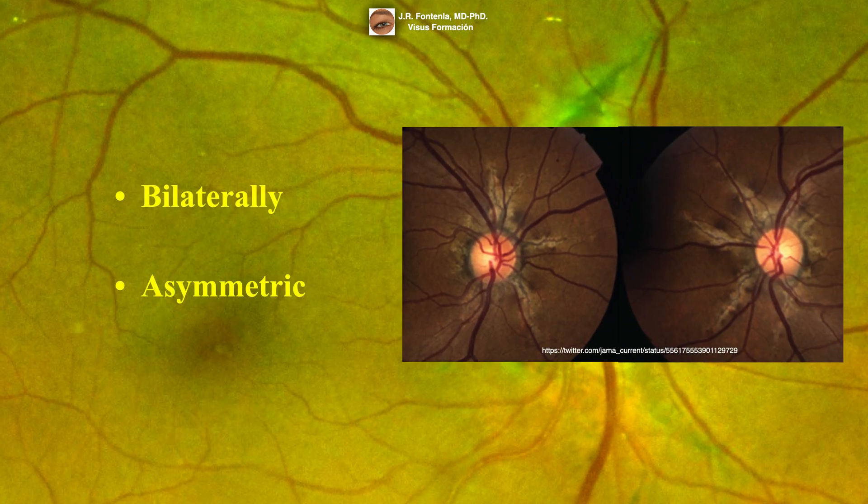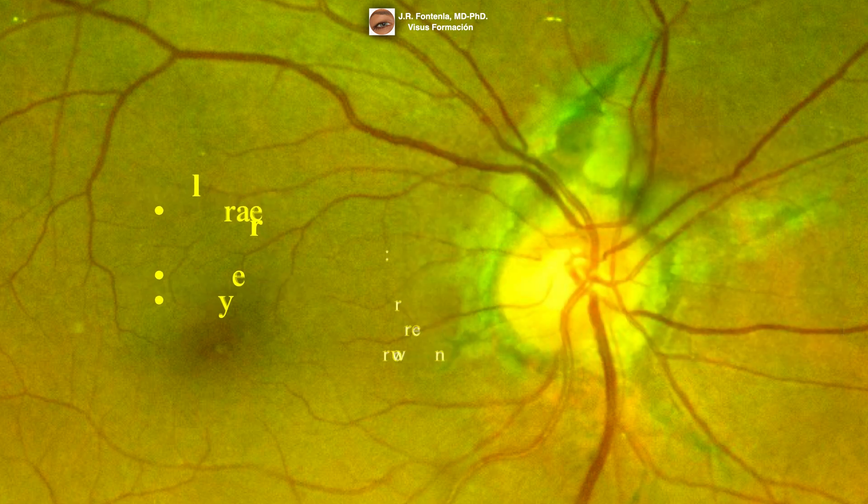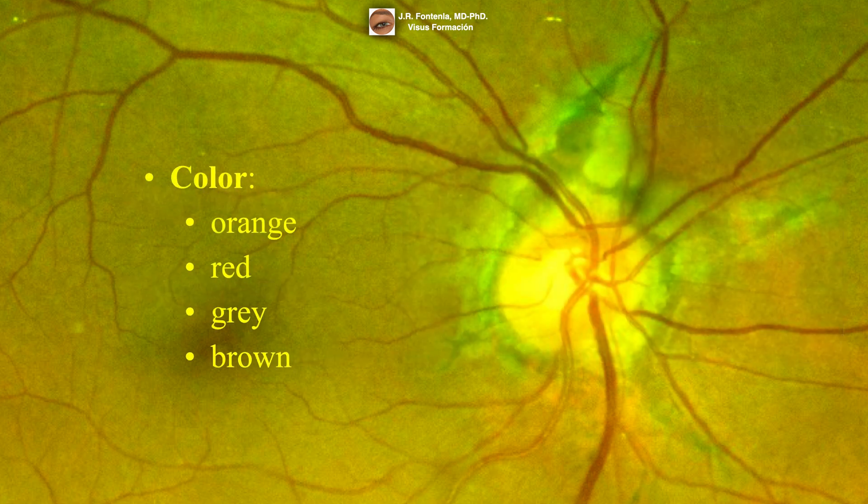Angioid streaks occur bilaterally but asymmetrically. They are orange, red, gray, or brown in color.